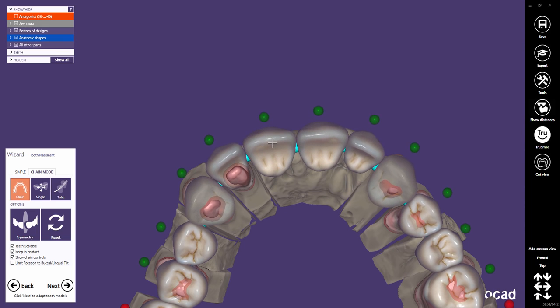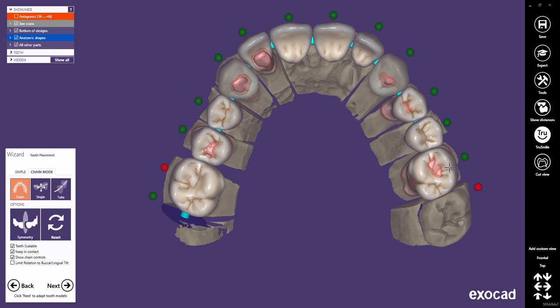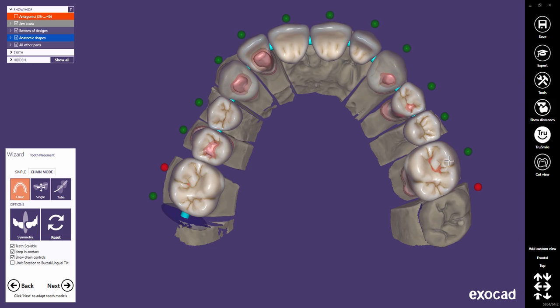Rotating a single tooth will also rotate a series of teeth in the buccal-lingual direction — the bigger the distance, the less the rotation's influence. When you scale a tooth and the ends are pinned, the center of that tooth is used for scaling.